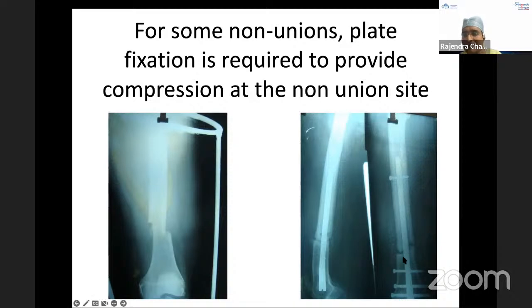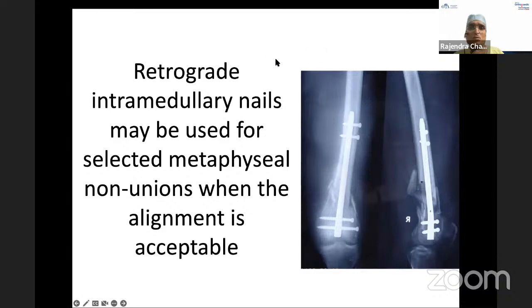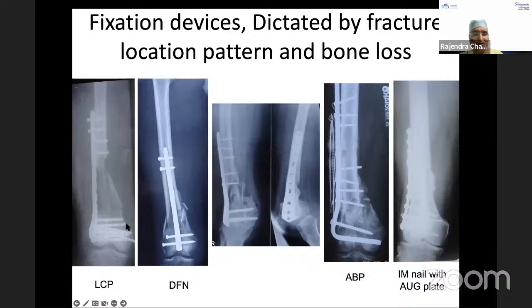Of the various choices available, there is removing the implant and compressing the fracture. That was one non-union which we revised with an angle blade plate. So an LCP and a non-union, a distal femur nail and a non-union, a lateral locking plate and a non-union, in all of these situations the angle blade plate gives a very effective purchase of the distal femur. Even if there is a lot of bone void, loosening of the screws, inadequate bone stock, even if you have just 3 to 5 centimeters of the distal femur, the angle blade plate gives you the best implant to keep a hold and give absolute stability.